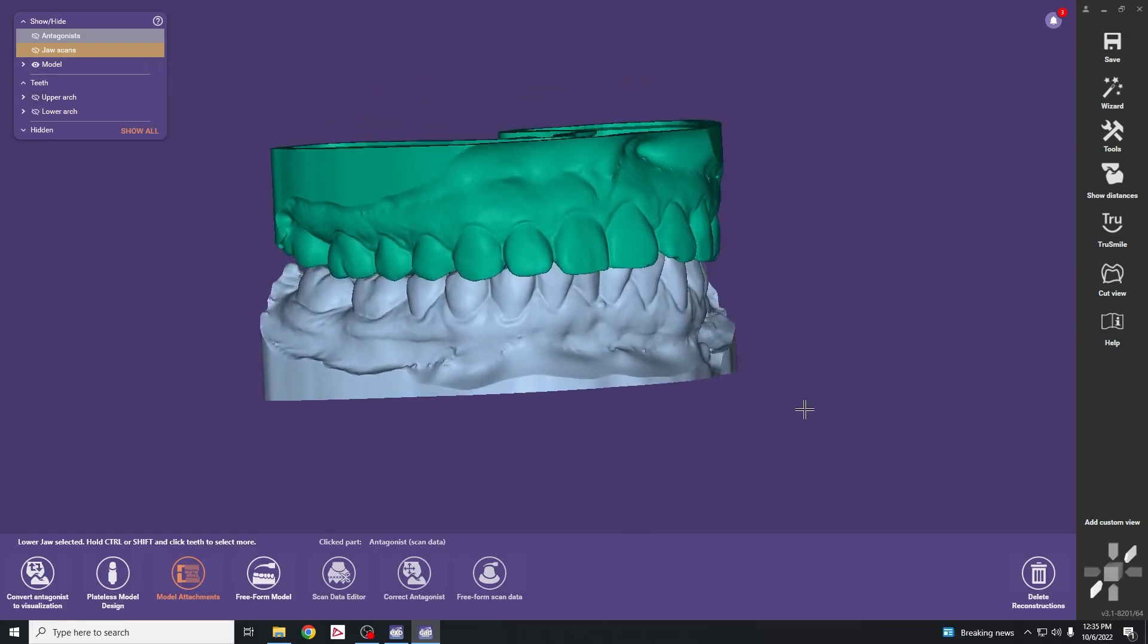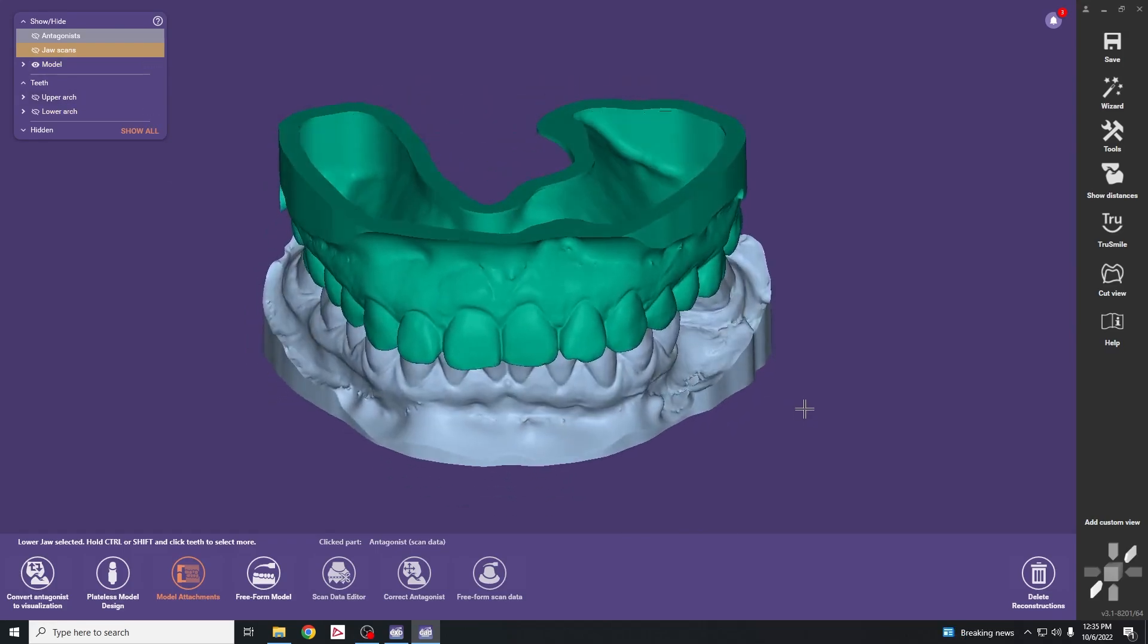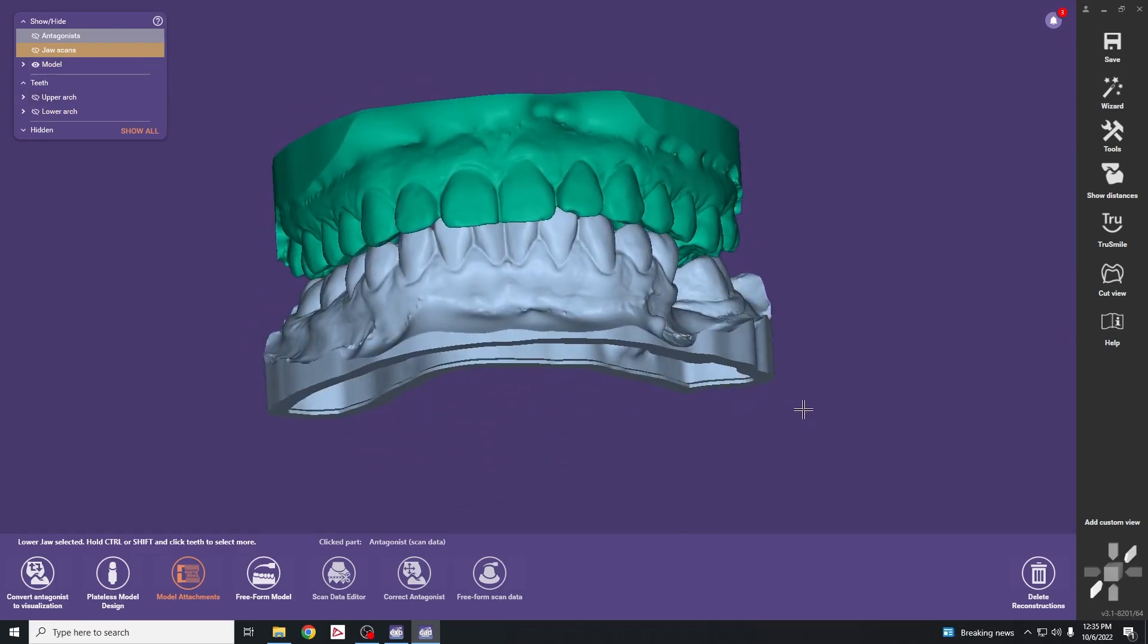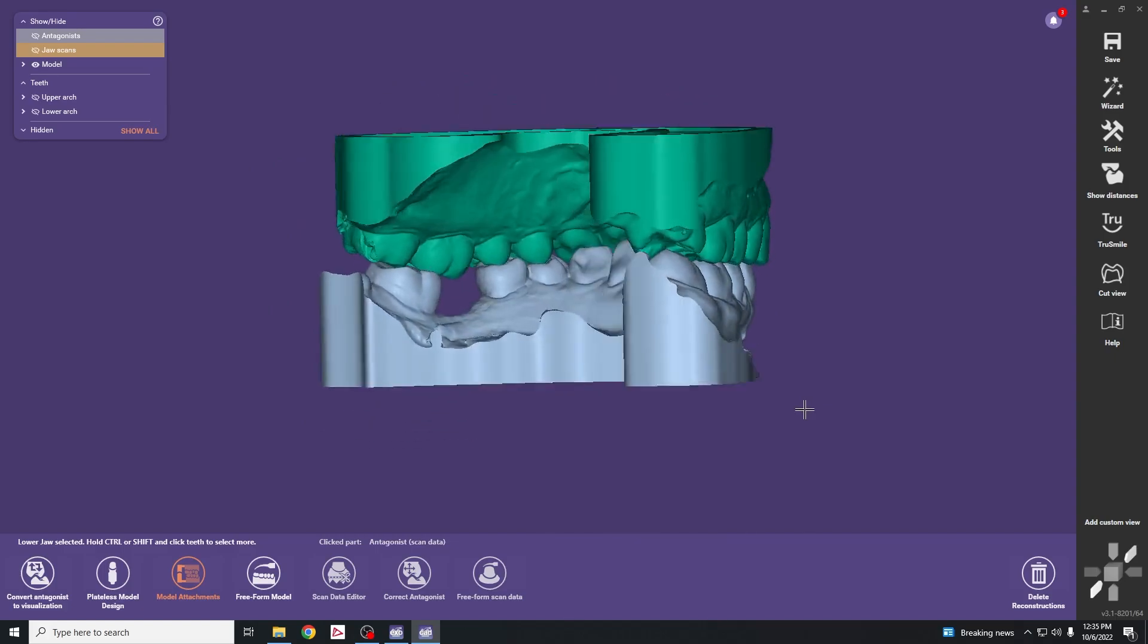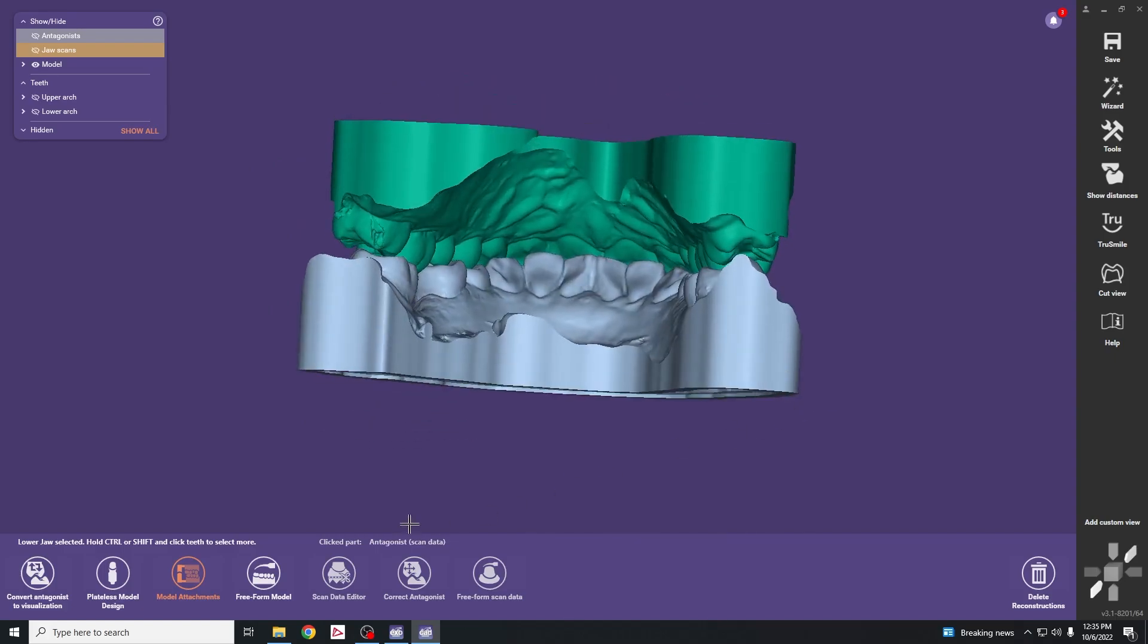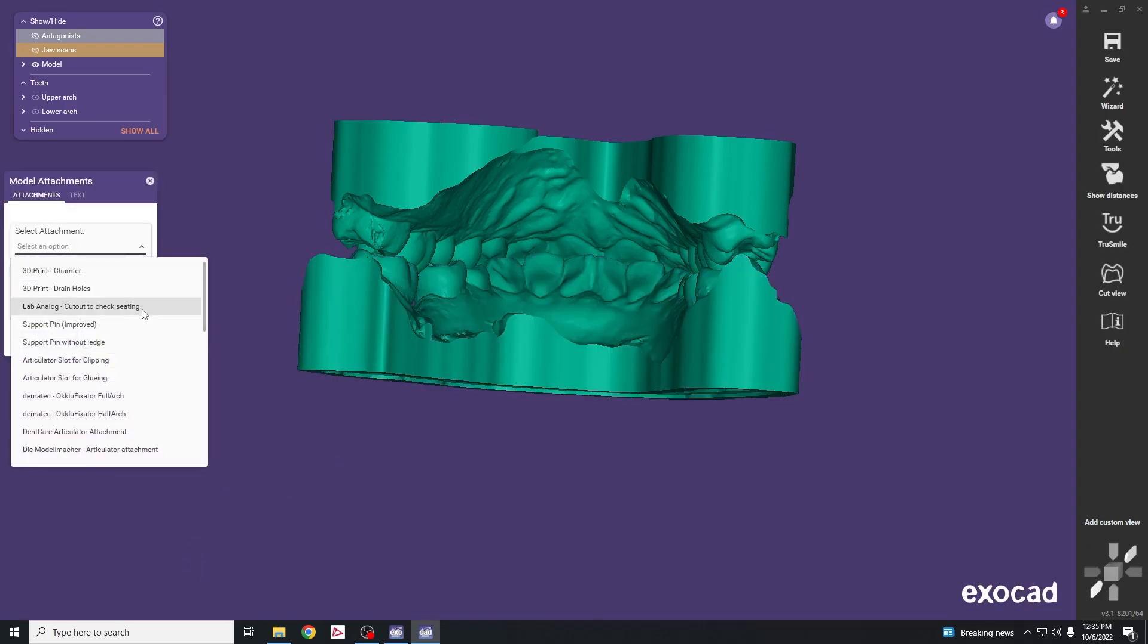At this point we can export this out or add some model attachments. At the bottom we can find model attachments and there are different types we can use.